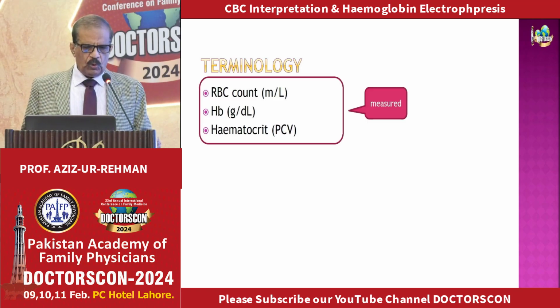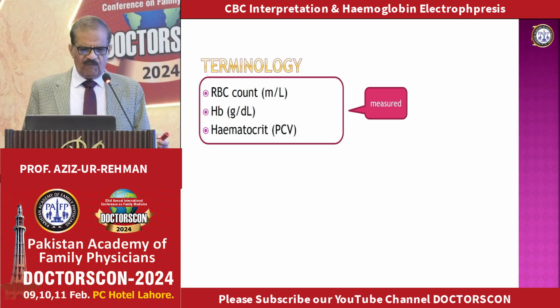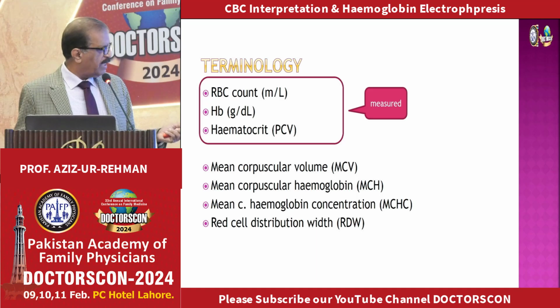RBC is the red blood cell count, which is like 5.5 million in men and 5 or slightly less in women. HB is measured in grams. It's like chemical test. Hematocrit is total packed cell volume. And these are directly measured by the machine, the counter, the auto-analyzer. But there's a built-in computer in this machine, which calculates many values like this one.